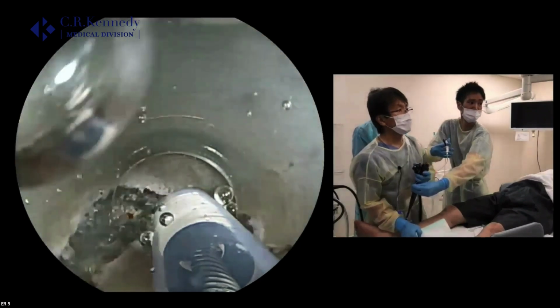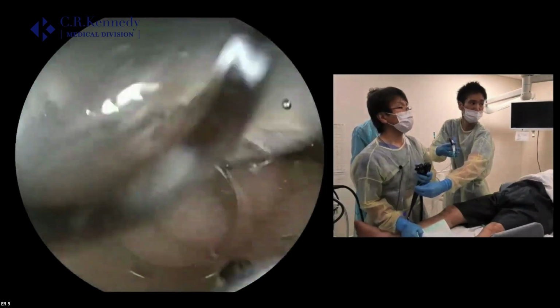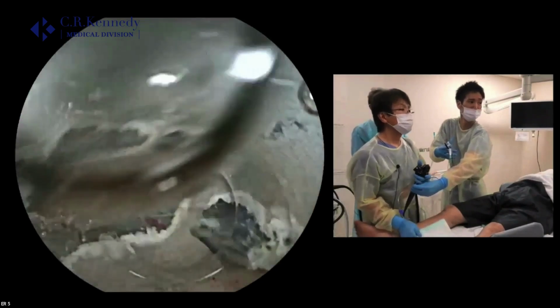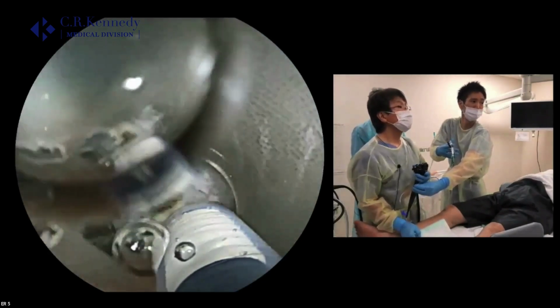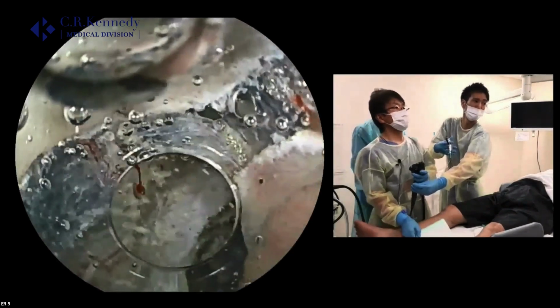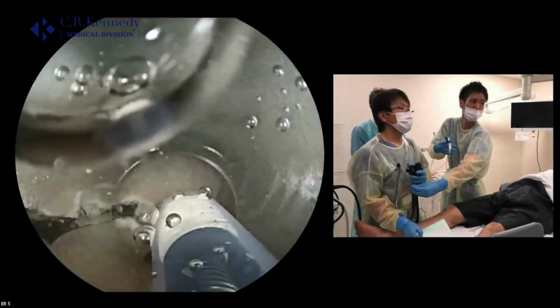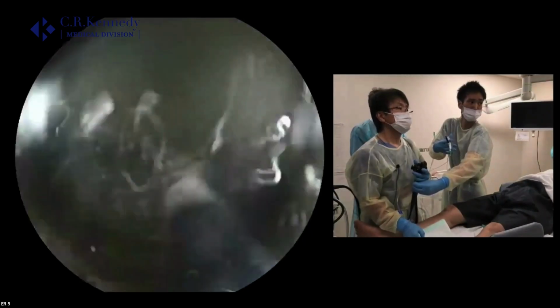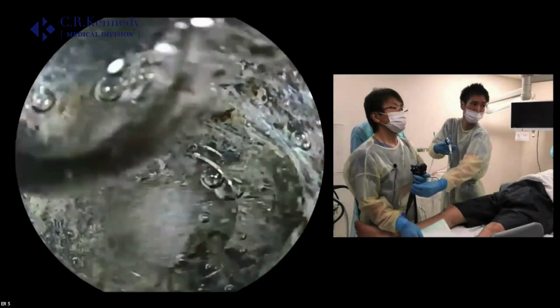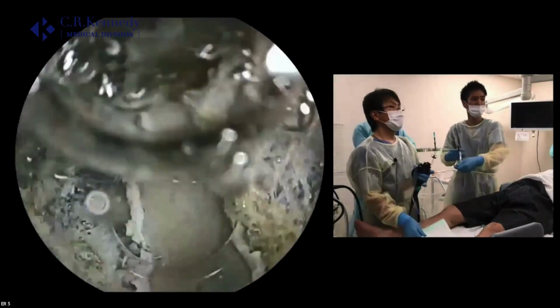So in the water, even without traction, the specimen floats. So it is possible to continue the incision and dissection, having enough space for the procedure, and cut and finish the procedure. This is the last cut. Okay, that's it.